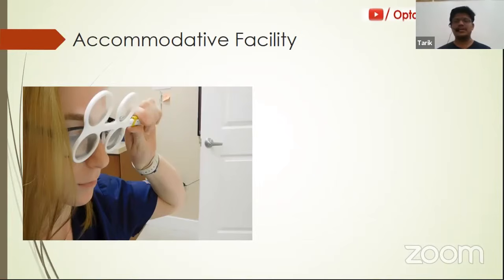As I explained earlier in NRA and PRA, you use accommodation as well as convergence and divergence whenever there is a set of lenses in front of your eye, and a similar concept is used here. The expected finding within 1 minute should be around 8 CPM or more. So what is 8 CPM? One plus side and one minus side is taken as 1 CPM. If I read once with the plus side and once with the minus side, that is 1 CPM.